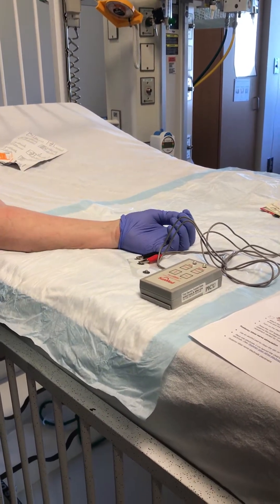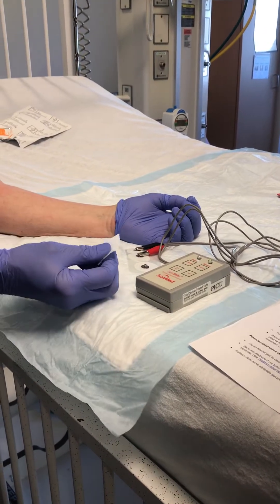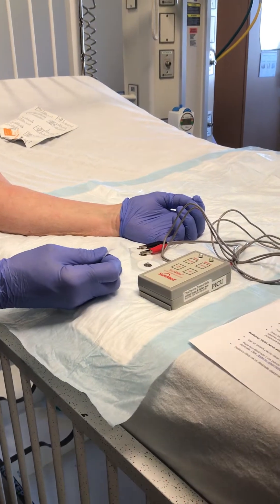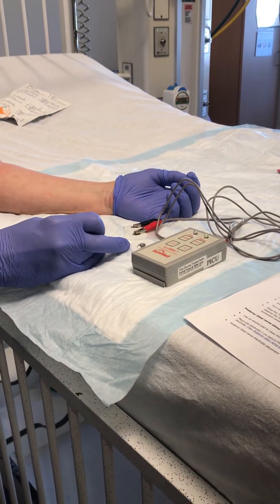This is the equipment video for the peripheral nerve stimulator. The equipment you will need is an alcohol pad, the stimulator, the nerve stimulator itself, and electrodes.